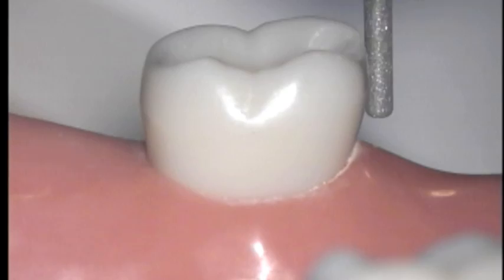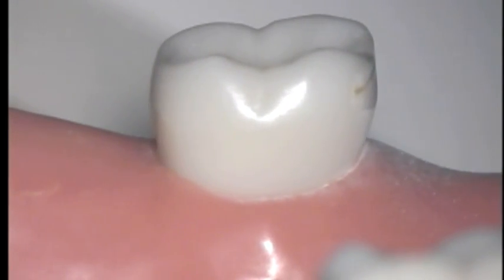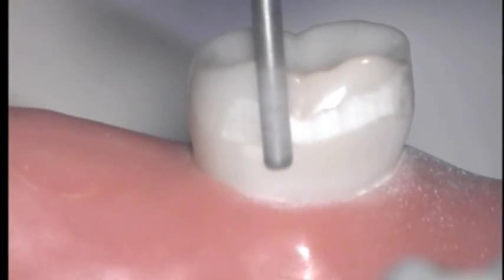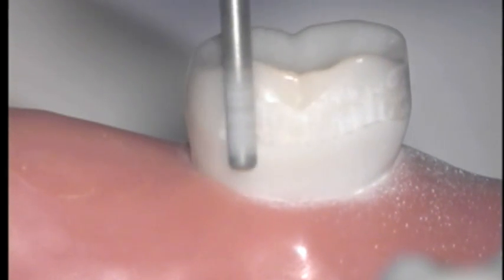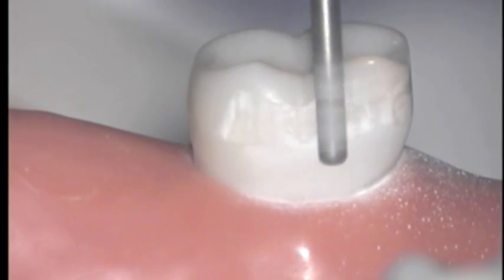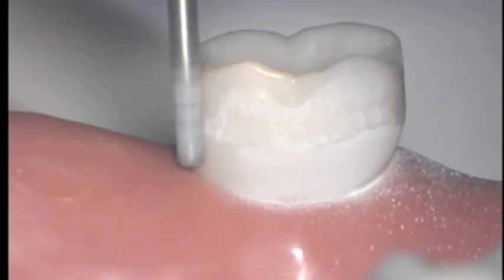Let's take a look at how to prepare some guide planes intraorally. Use a long, cylindrical, medium-grit diamond burr from your kit to prepare your guiding planes. Make sure to orient the burr anterior-posteriorly and medial-laterally, similar to how you oriented your analyzing rod to your cast on your surveyor. Use a rolling motion from buccal through proximal to the lingual surface so that you round the corners and preserve the shape of the tooth. Make sure you prepare at least a 2 to 3 millimeter guide plane before you remove your burr from the tooth.